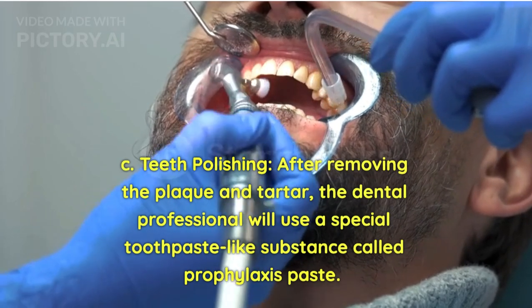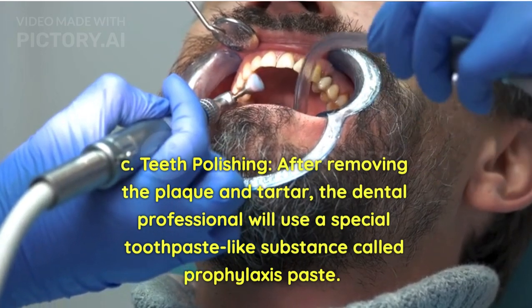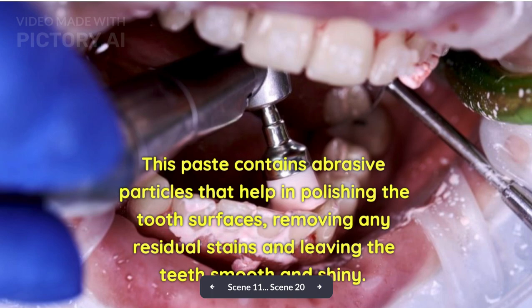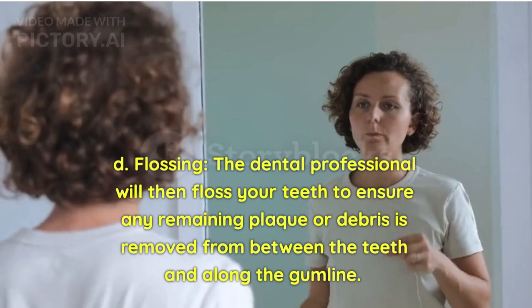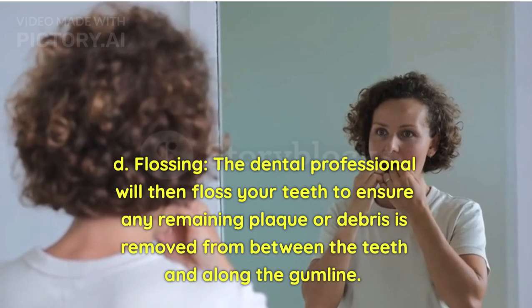Teeth polishing: After removing the plaque and tartar, the dental professional will use a special toothpaste-like substance called prophylaxis paste. This paste contains abrasive particles that help in polishing the tooth surfaces, removing any residual stains and leaving the teeth smooth and shiny. Flossing: The dental professional will then floss your teeth to ensure any remaining plaque or debris is removed from between the teeth and along the gum line.